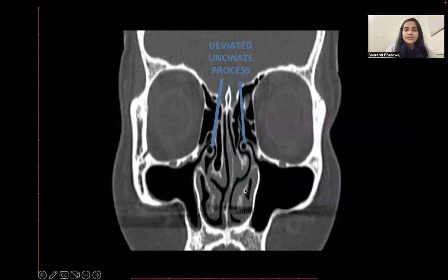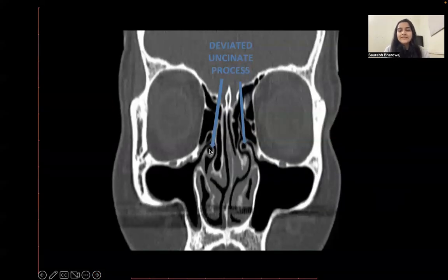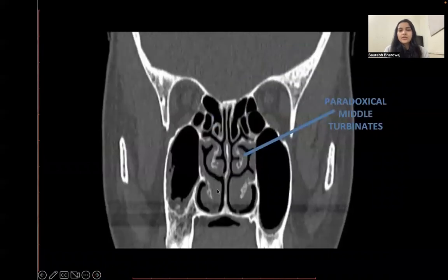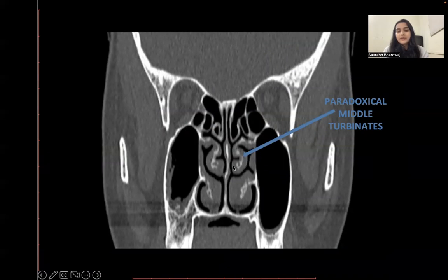In this coronal reformat image we can see a pneumatized and deviated uncinate process seen bilaterally. In the next coronal reformat image we can see a paradoxical middle turbinate, which is when the concavity of the middle turbinate is present towards the nasal septum.